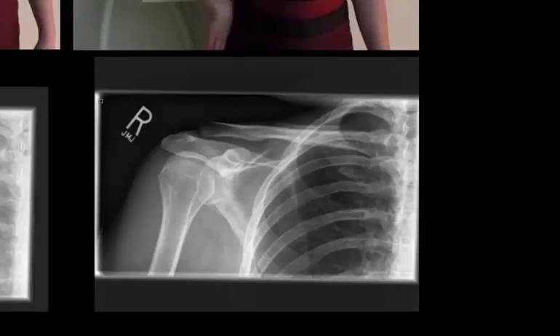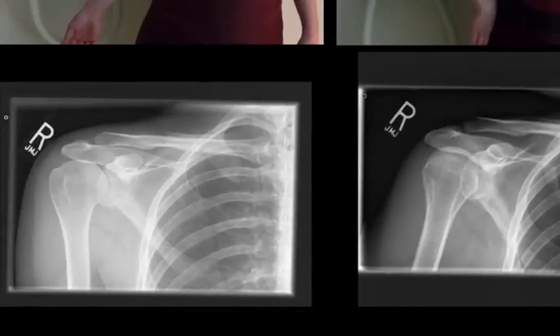As we look at the proximal end of the humerus, we can notice the difference between the external and internal. The greater tubercle is no longer in profile. And sometimes we may look at the humerus and say it has somewhat of a snow cone look. Let's go over here and compare it to the external rotation that does not have that. We can see both the greater and the lesser tubercle here, but the greater tubercle is in profile.